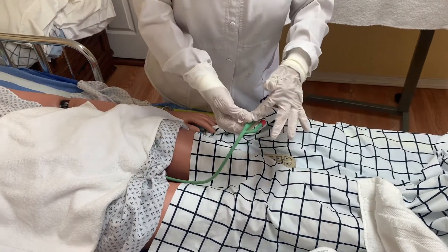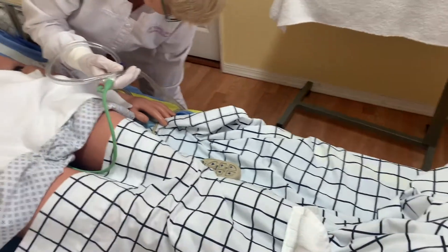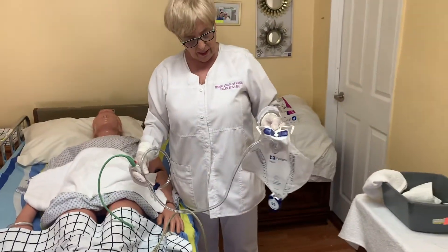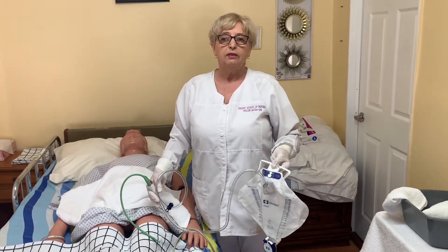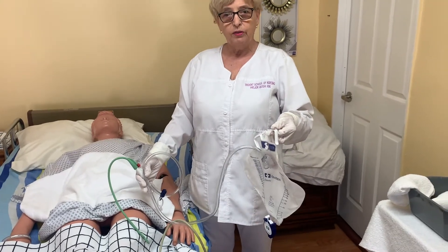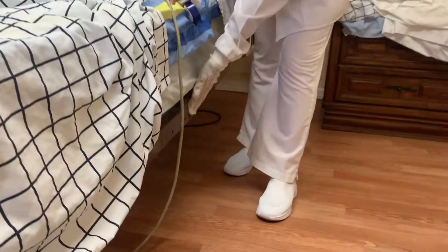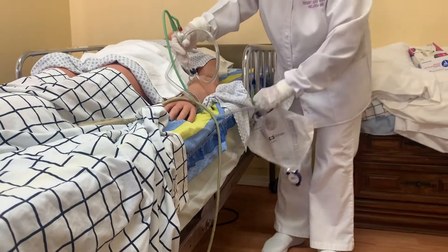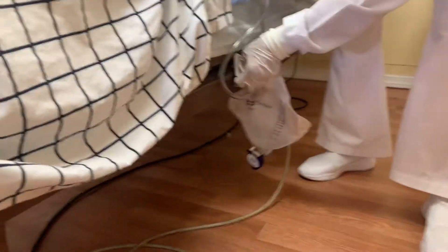The Foley catheter is connected with the tubing that goes down to the bed bag. Why do they call it a bed bag? Because people use this bag when they are in bed. When they are out, they use a leg bag and replace the bed bag with the leg bag.